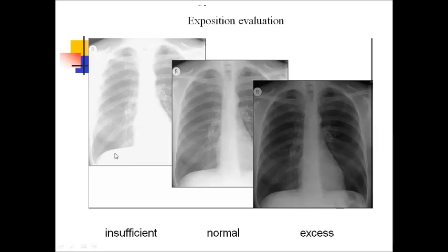In insufficient and excess exposure, small details disappear and you cannot make a proper conclusion about the status of the lung and the presence or absence of lung pathology.